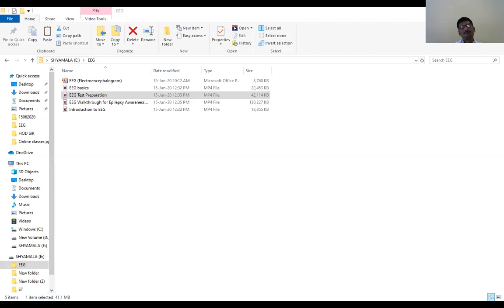If we had to use the collodion method, we will need to use acetone for the removal. Women may recognize the smell of acetone since it is present in fingernail polish remover. This odor is also quite strong. For the babies and smaller children, we also have a non-acetone remover, which requires a little more scrubbing and has an oily base to it.